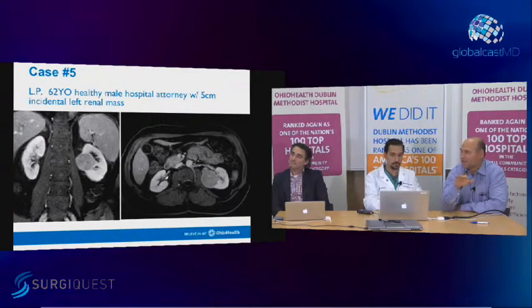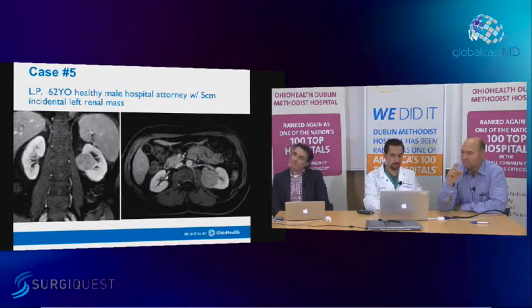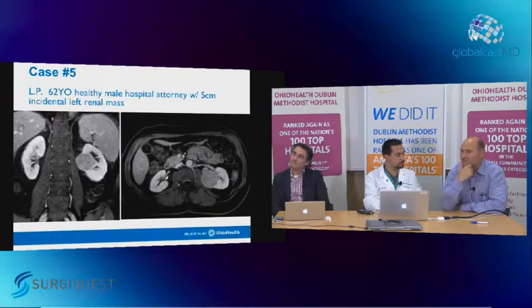I can do all that in preparation. And then all you really have is this parenchymal connection between the tumor all the way down to the sinus. And in fact, it's not a lot of surface area to be operating on in many cases.